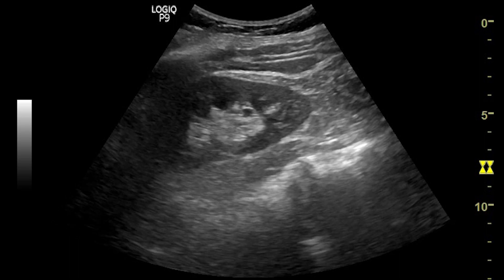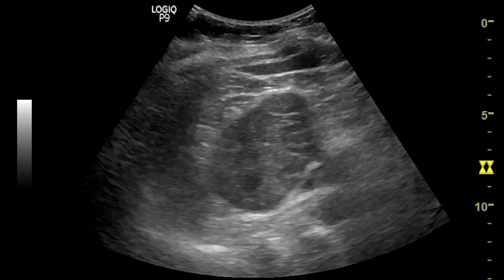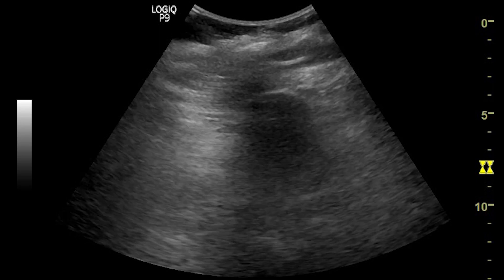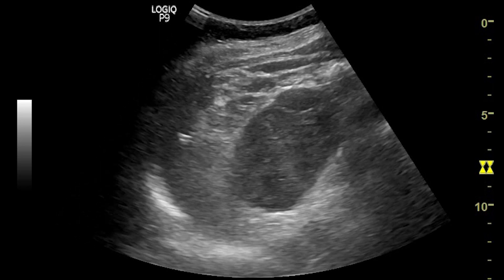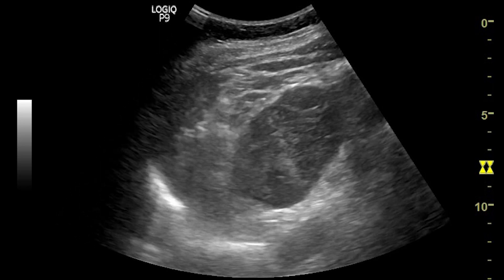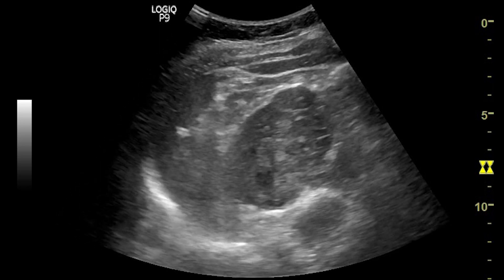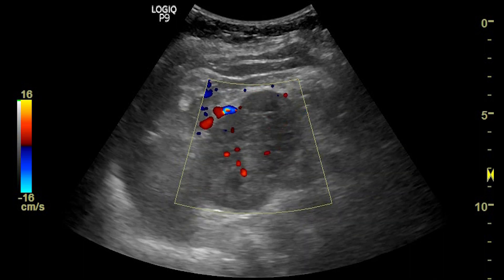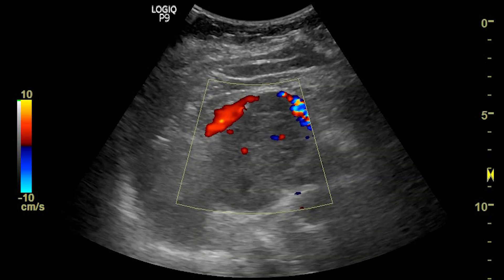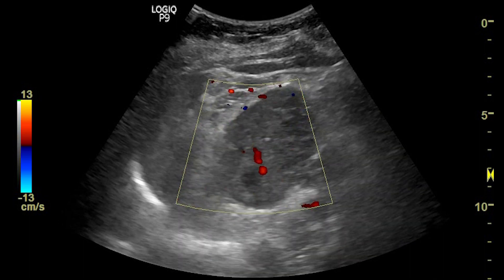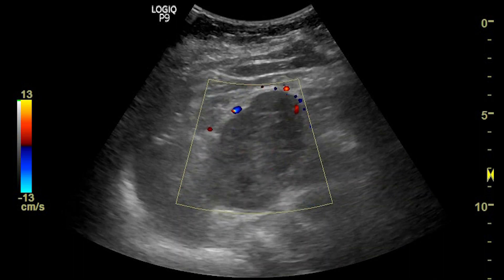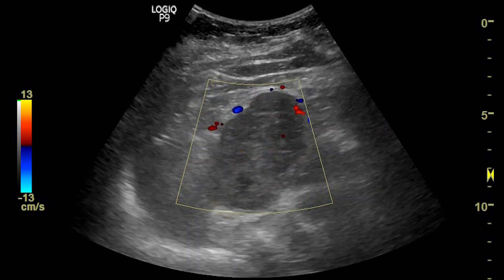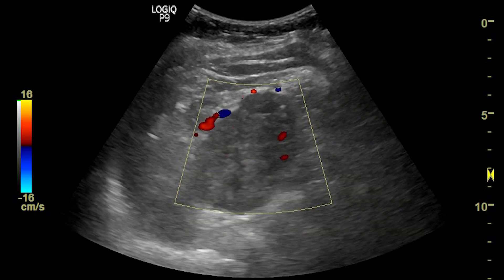On real-time, you can see the heterogeneously hypoecogenic, ill-defined irregular mass at the upper polar renal region, which is continuous with the renal parenchyma. Color Doppler shows internal vascularity within the lesion, and the mass displaces peripheral renal vessels.